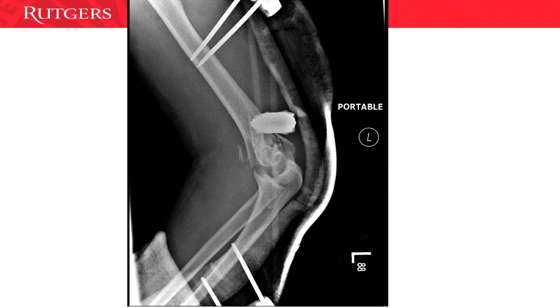Extremity surgeon? Would you want me to X-fix it or just wash it out, put it in a splint, send it to you? Just wash it out and put a splint on. I think it'll be fine. What if it was going to be an unknown period of time till transfer? Did you hurt the patient with the fixator? It ended up getting a radial nerve palsy, but then it came back okay.